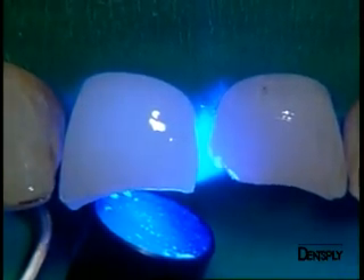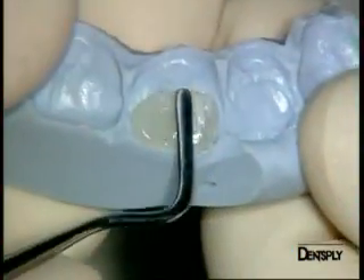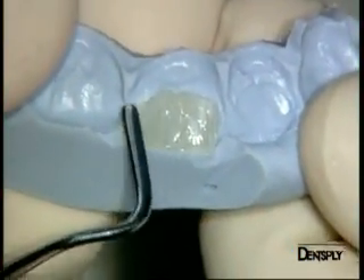The adhesive system is light cured on all surfaces. We are now going to place the first composite layer.